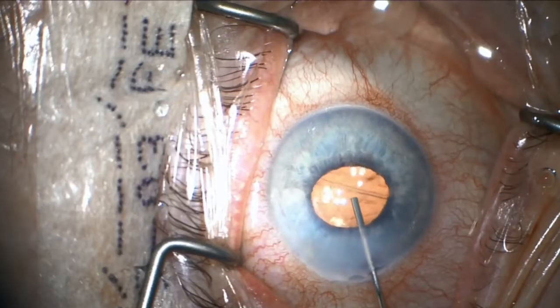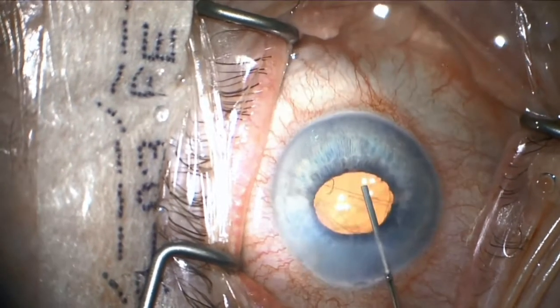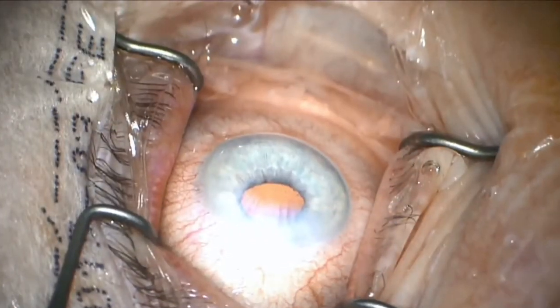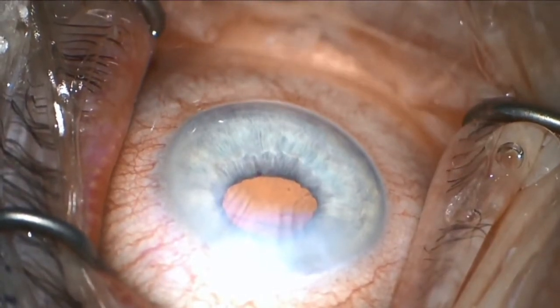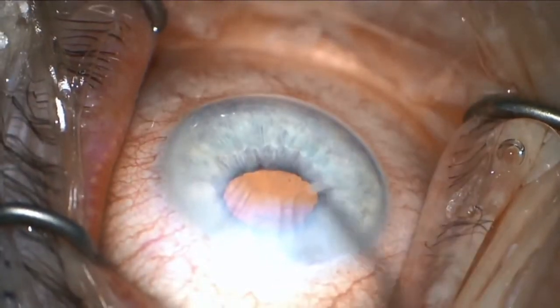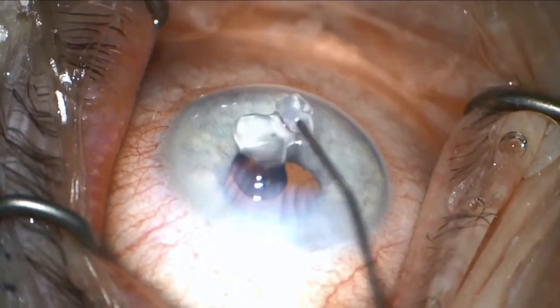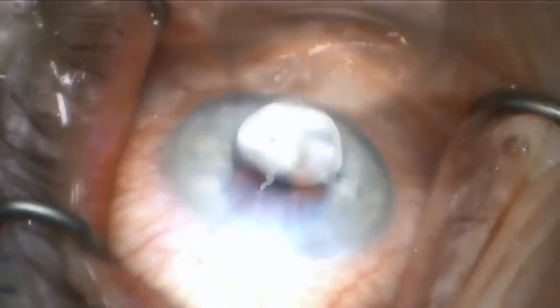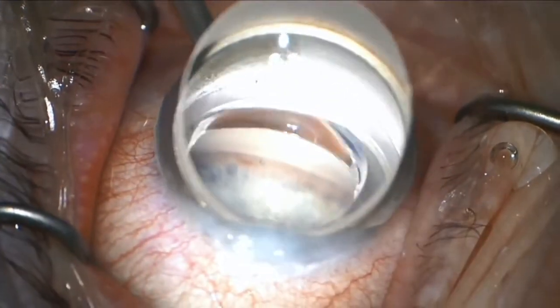Hi, this is Brian Morgan. We're going to be narrating an eye stent video. The very first step is, after we've removed the cataract, we use a little bit of viscoelastic to kind of open the anterior chamber angle. We tilt the head of the patient about 30 degrees away and tilt the microscope as well.